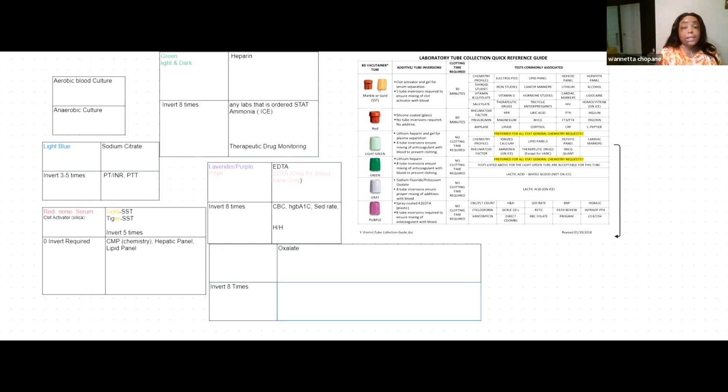And if you want to take out your requisitions and find glucose, you'll see it says GRY for gray, or it'll say GY for gray. Whatever the case may be, it stands for gray, okay? Fasting glucose level. Also, another most common test, which you do see on your sheet, and there's only one that you see, is lactic acid, and as you can see, lactic acid also goes on ice.